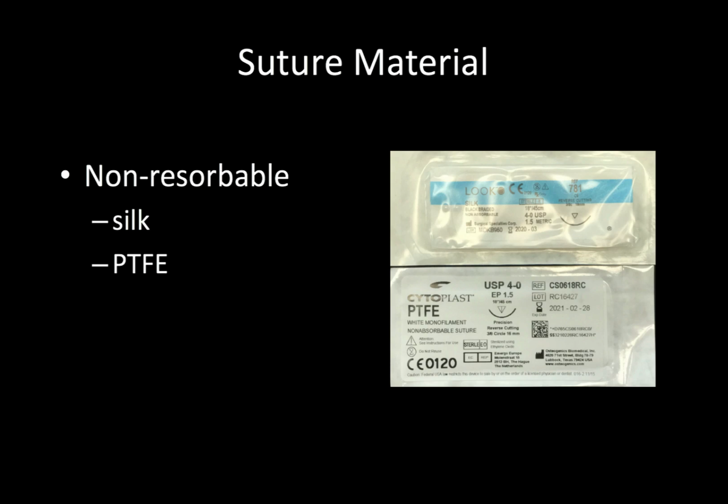Polytetrafluoroethylene, or PTFE sutures, are another option. They have the advantage of having minimal tissue reactivity, but can be challenging to work with on an initial knot tie. They have good tensile strength, and because of their minimal tissue reactivity, can be left in place for many weeks.